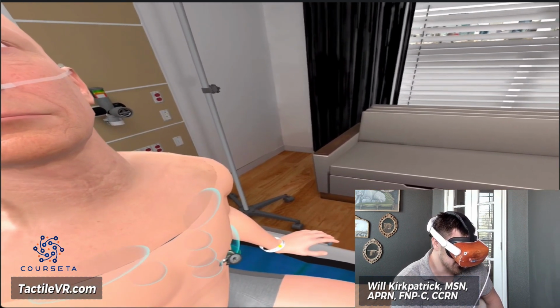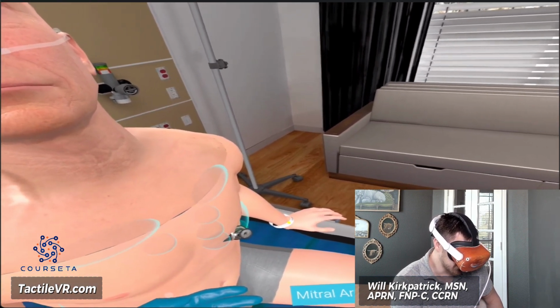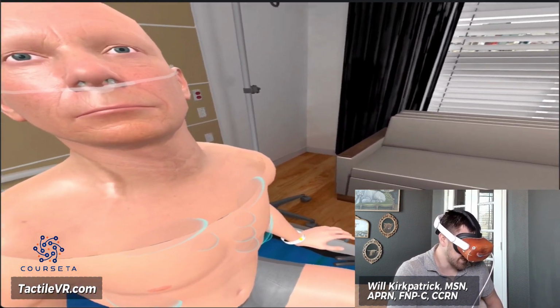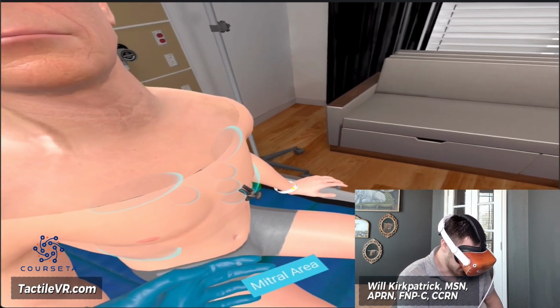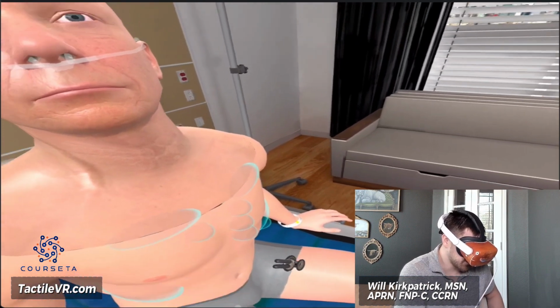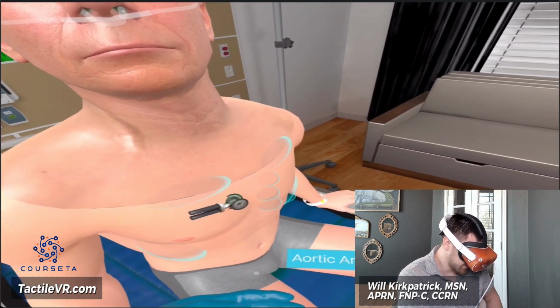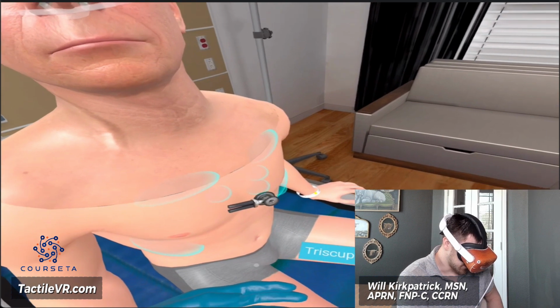This is listening to the mitral valve, which is a very important valve to listen to, especially because it's on the left side of the heart, and the left side of the heart is responsible for pumping blood to the rest of the body. So that's why it's so important. This is also the easiest place to listen to the heart sound in general because it is your apical impulse. It's very strong. So that is the reason we have the names for these: each landmark tells you what valve you're actually listening to best.